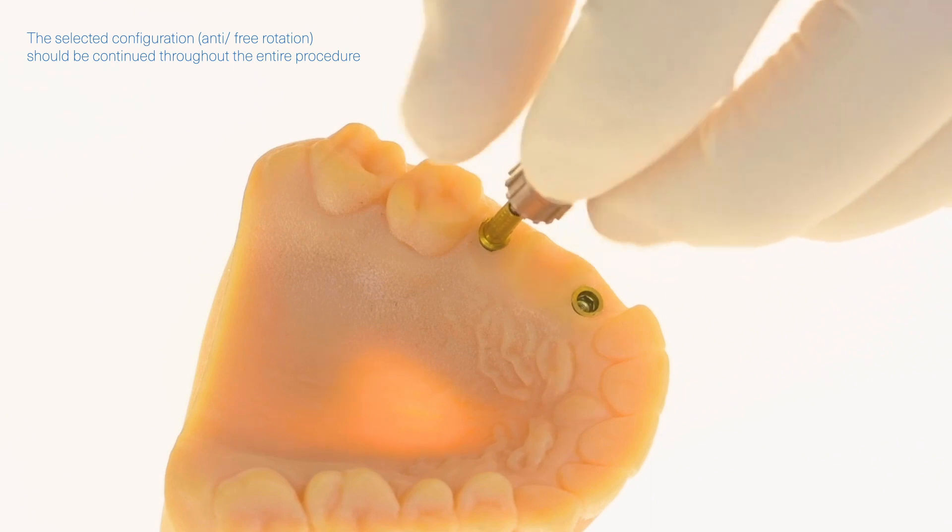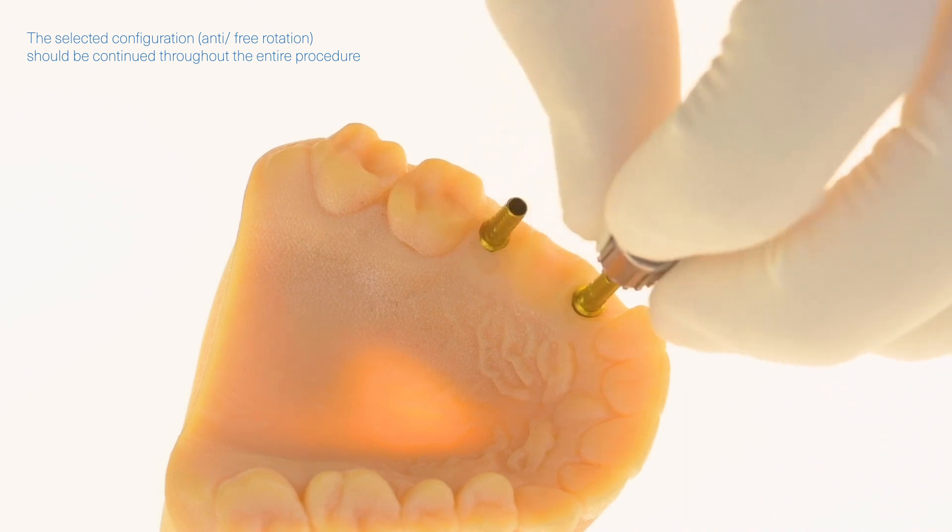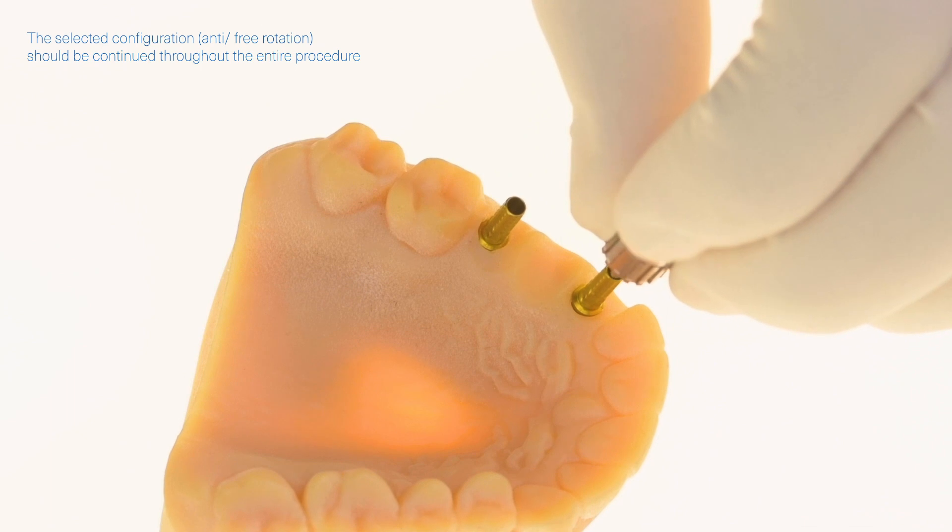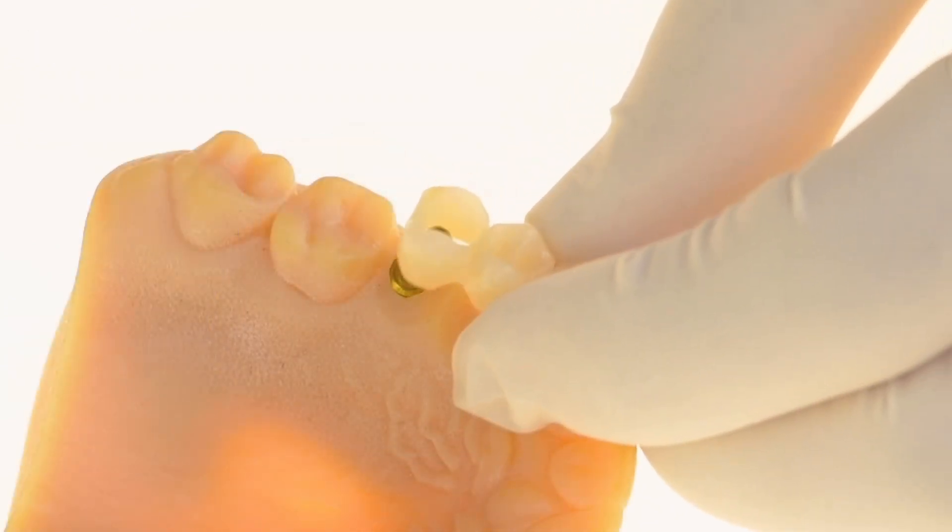For multiple unit bridges, you can restore using free rotation components or a combination of both free rotation and anti-rotation abutments. This may be followed by placing a temporary bridge.